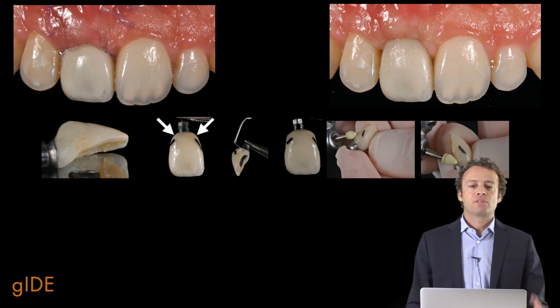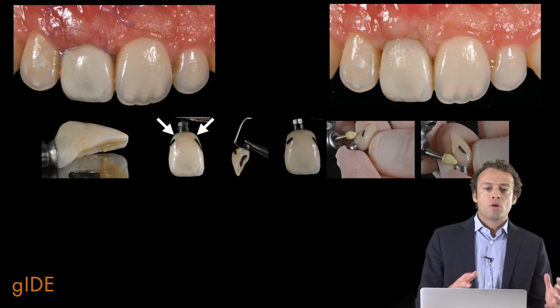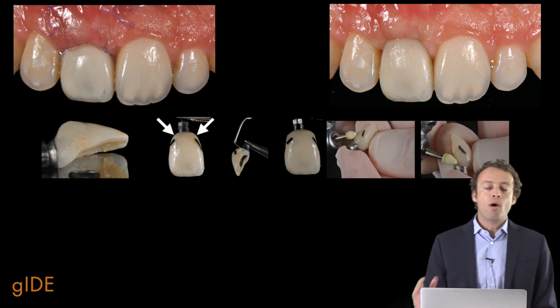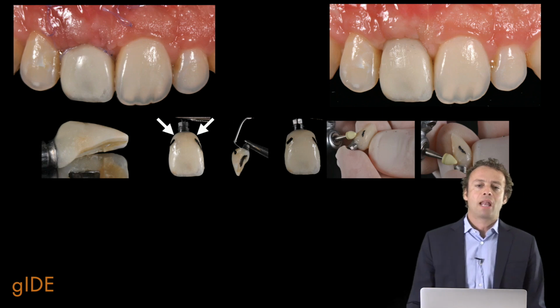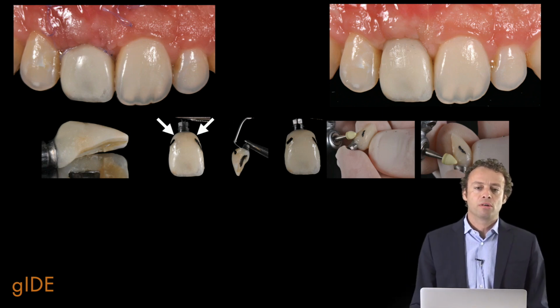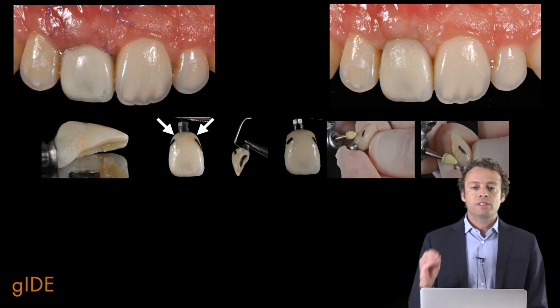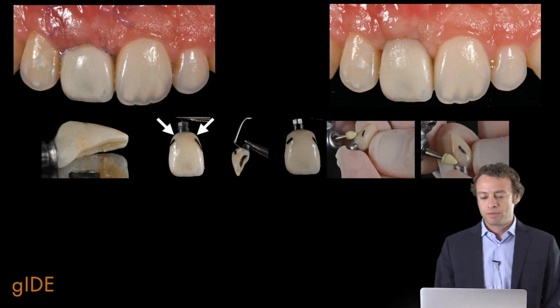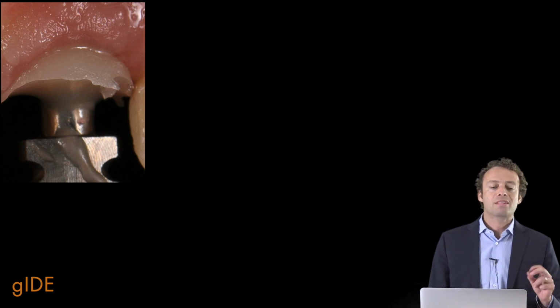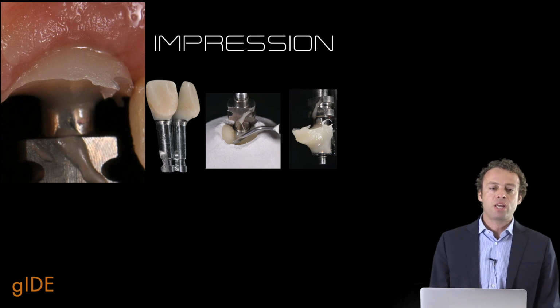So at this time it's really important to take a good impression in order to give the dental technician the chance to have a model that is absolutely reliable, both in terms of 3D implant position, and in terms of soft tissue architecture. So in these simple clinical situations, the technique consists in creating a sort of customized impression coping using the temporary restoration.